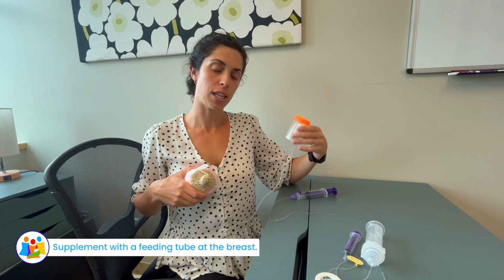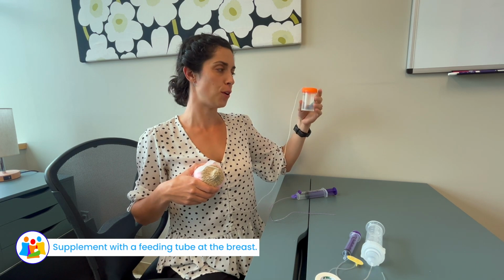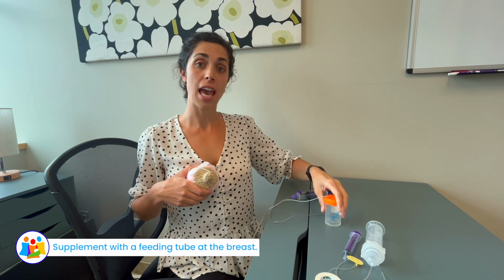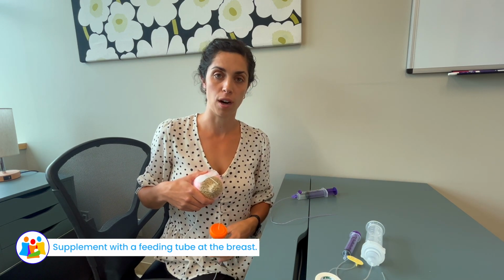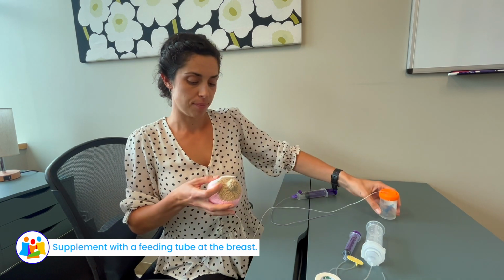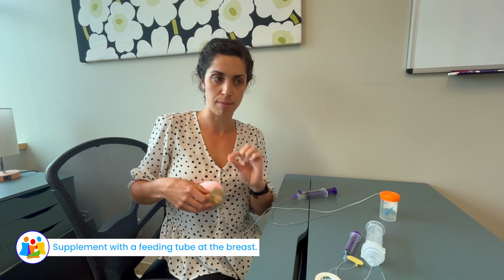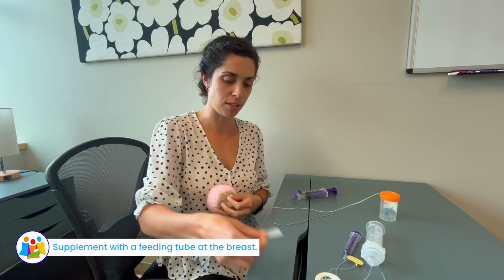When a baby's learning to do this, they may appreciate the little added flow from having this elevated on a bookshelf or a coffee table, and then as they improve their skill, it can be at chest or eye level, and then even lowered below eye level so that the baby really has to drive more of the milk to flow. Sometimes I apply a little bit of olive oil on the end of the tubing to help it slide into the baby's mouth, just to get the dyad really started using it.